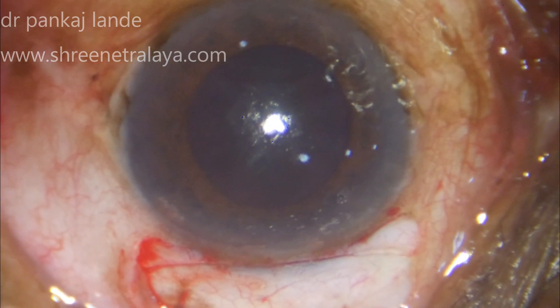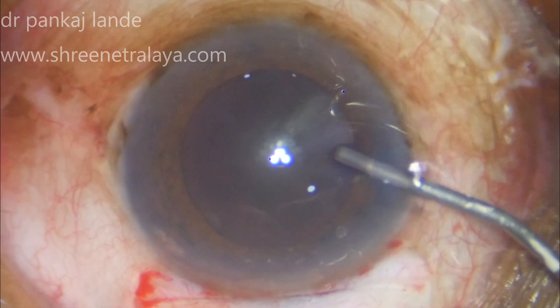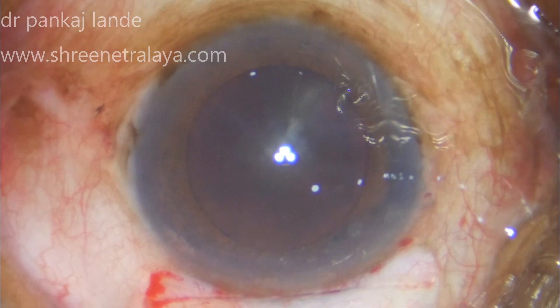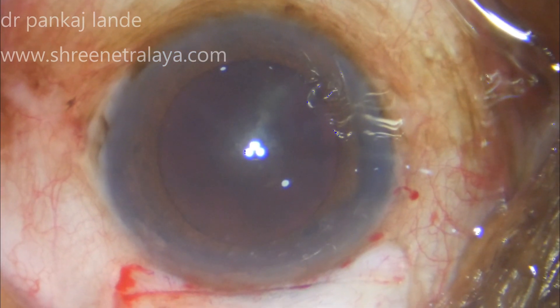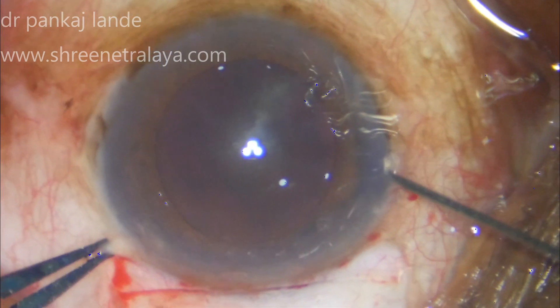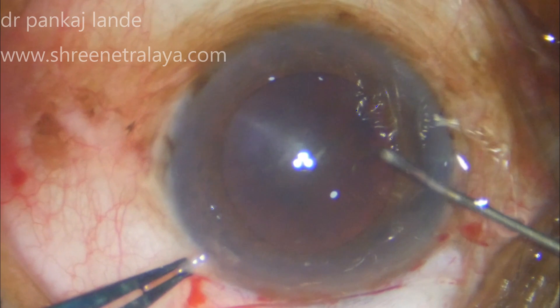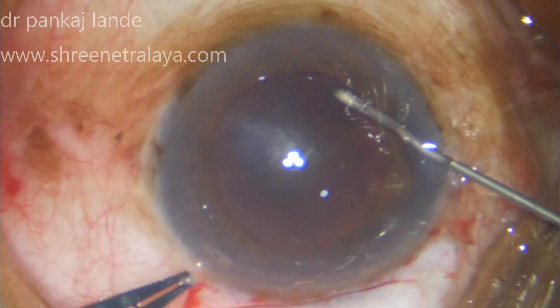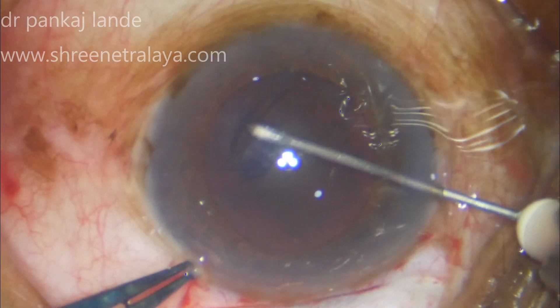This is followed by a side port entry. Here I am using my keratome to enter through the side port. This is followed by viscoelastic injection into the anterior chamber and CCC. Note that a slightly larger size rhexis is preferred in these types of cases with black cataract.